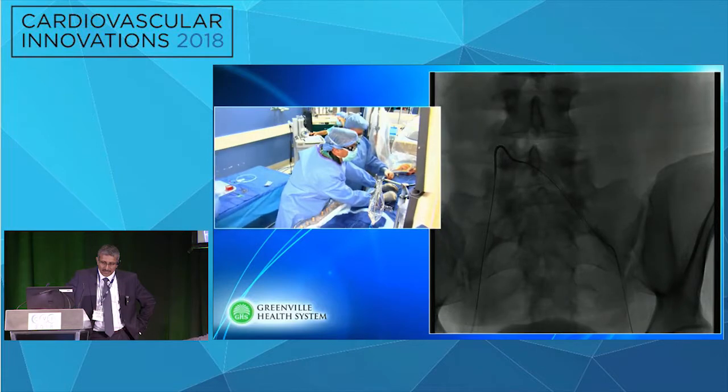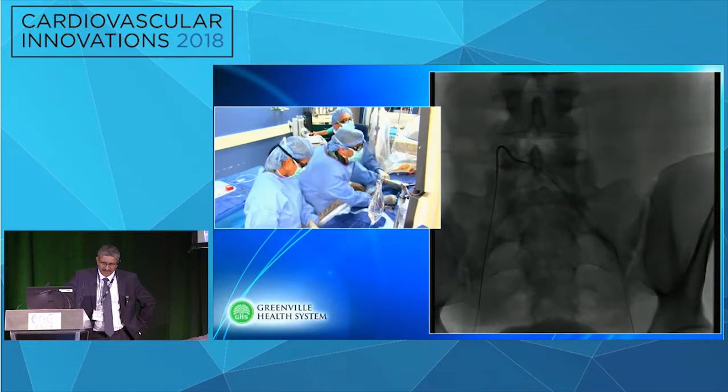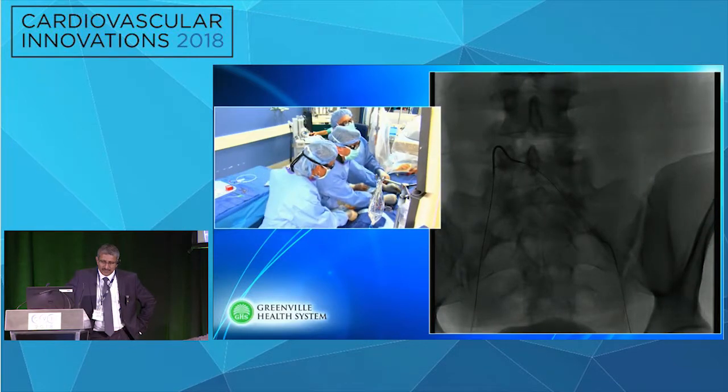Give me a, pull the antegrade out. Leave the wire, pull the antegrade.